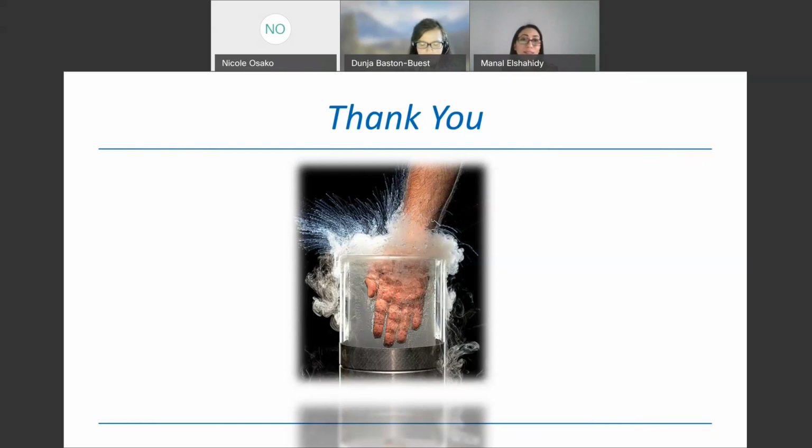Yeah, international shipping. I've got experience from our cryobank, and there we put a label on it: don't X-ray. And hopefully it works. It's just the same for cord blood. We also have a cryobank for cord blood at the university, and they do the same for worldwide shipping. I think it's advisable to put a sign on it, no X-ray, because this is human tissue and it should be transplanted or transferred, for example. So I would try to explain what's inside the container.